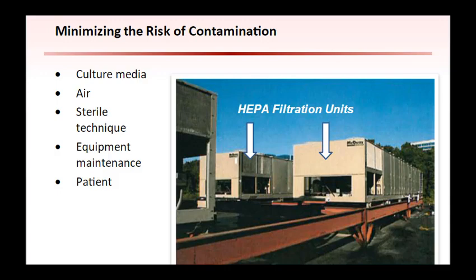Culture medium can be contaminated by numerous routes, including poor air quality, non-sterile technique, poor equipment maintenance, and from the semen sample. Minimizing the particle count in the air in an IVF lab is critical in order to minimize the possibility of contamination from airborne particles. All IVF labs use one of the following to reduce particulate counts: laminar flow hoods, standalone HEPA filtration units, or an HVAC system equipped with a HEPA filter, as shown on the image here. Air should be tested periodically for particle counts to ensure that the filtration system is functioning.